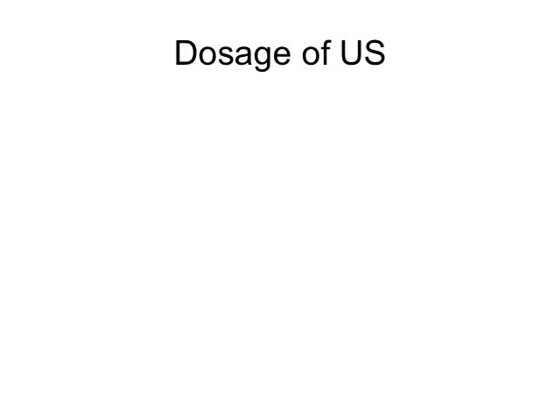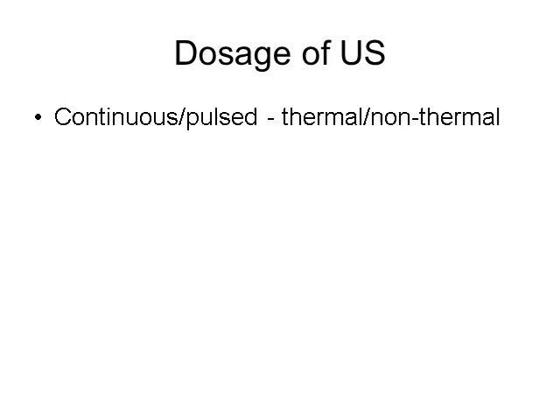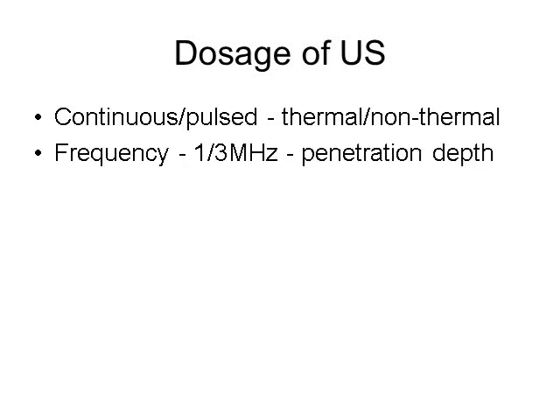There are many choices to be made regarding the dosage of ultrasound used in treatment. The choice between continuous and pulse ultrasound is generally one of determining whether you want thermal effects or not. Pulse ultrasound will allow time for the dispersal of thermal energy. Lower frequencies for the treatment head will travel deeper in the tissues. The half-depth figures introduced earlier may be a useful guide in determining whether you use, for example, a 1 or 3 MHz head.